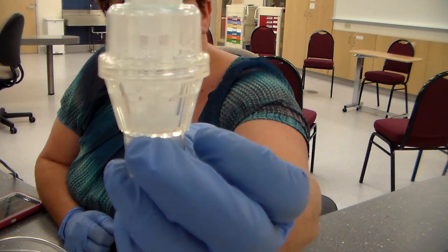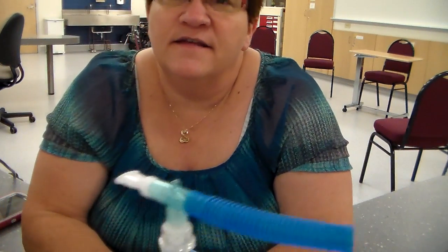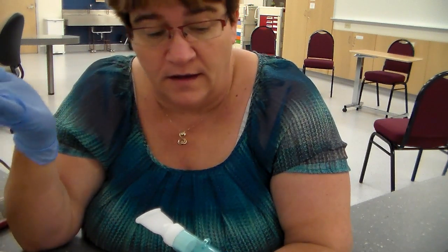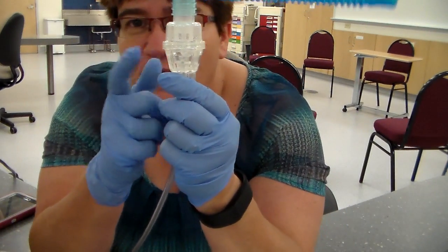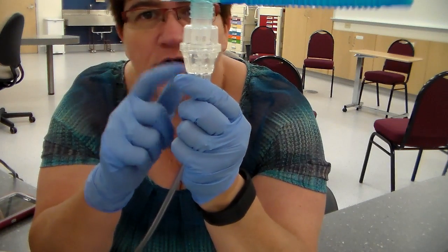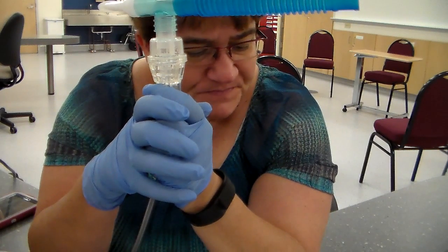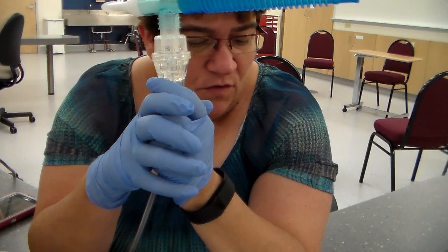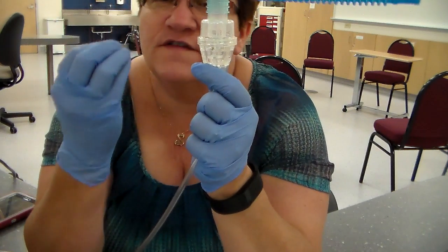You're going to keep them doing that. You're going to keep them breathing this in and out, okay? To keep them from talking, first of all, because they want to talk when they're doing it. Don't do that. You want them to just breathe regularly. You want it nice and deep, get it in there, okay? You want to do that until there's no more liquid in here, okay? You're going to take all that medication in, okay? You're going to have them deep breathe and hold for several seconds and then exhale slowly every 3 to 5 breaths. Okay, so make sure that they're just getting it in there.